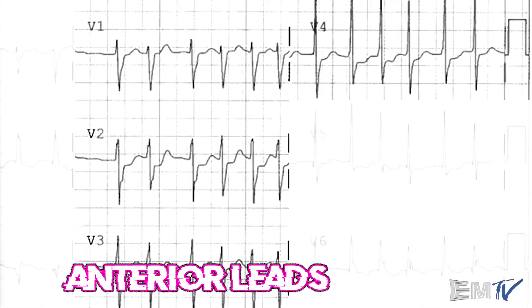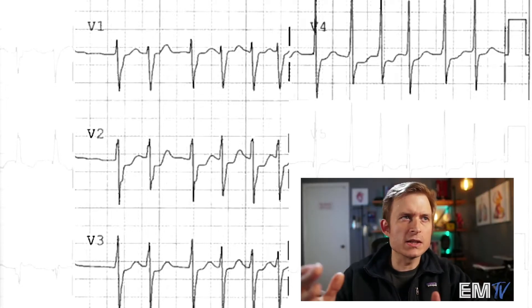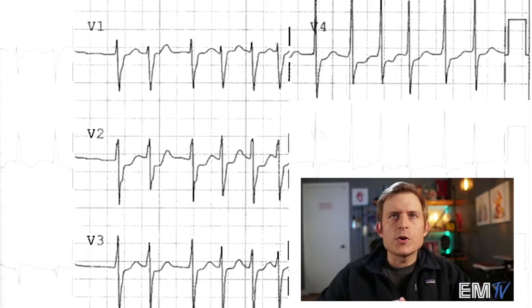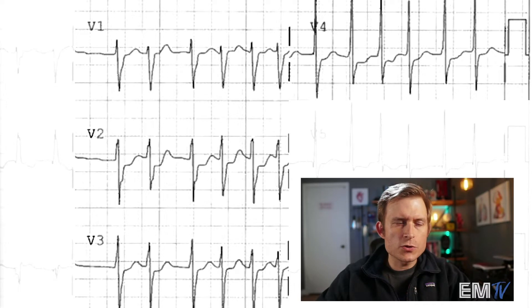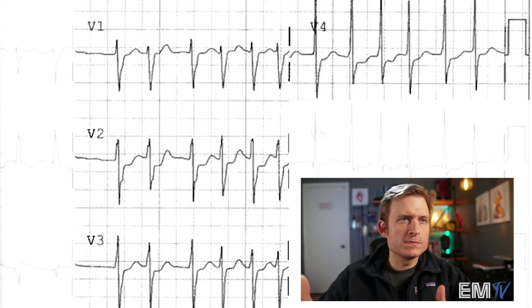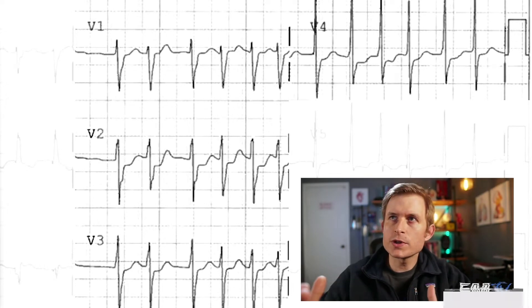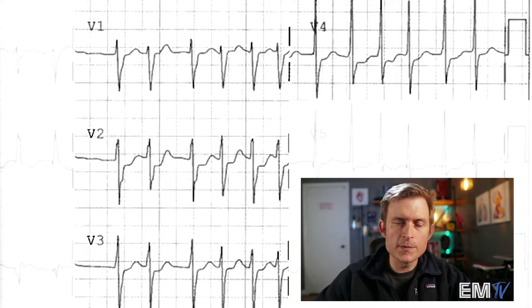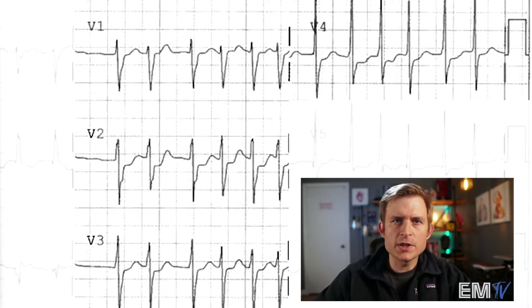In the anterior leads — V1 through V4 — I'm not seeing anything jumping out at me except a slightly widened QRS, which may be indicative of a pre-existing conduction delay. I'm also seeing a little bit of ST segment depression here, but this may be rate related. Generally, once you get the rate under control, the depression resolves itself. The rate is often going so fast that it's impacting coronary circulation and causing mild ischemia — this can be true in any variety of tachydysrhythmia, not just rapid AFib.